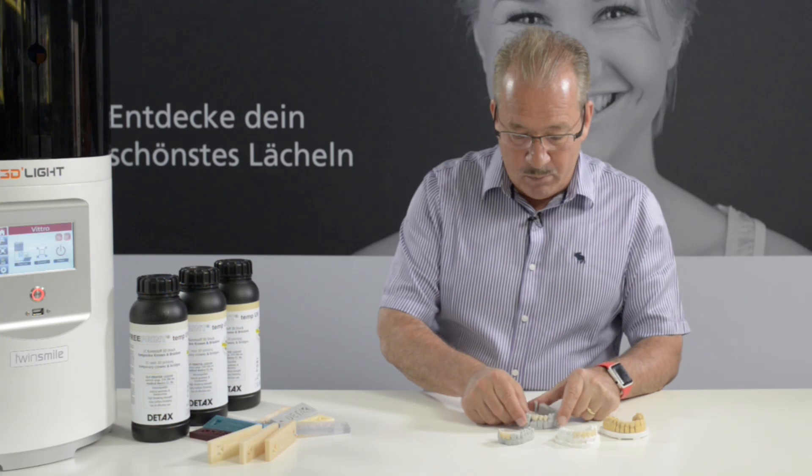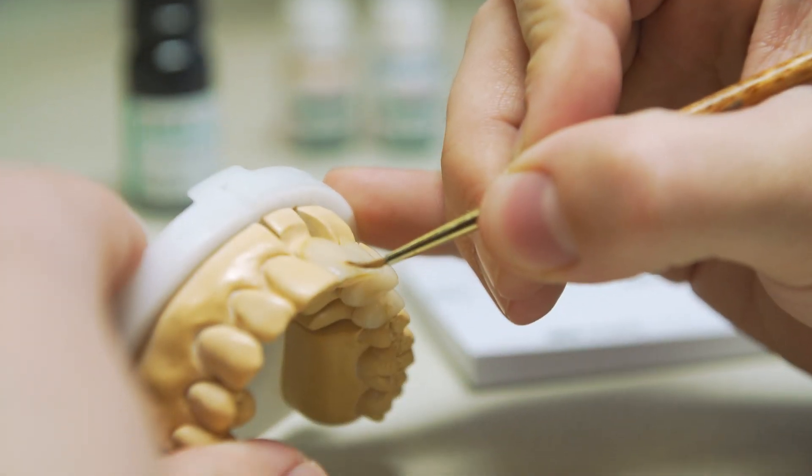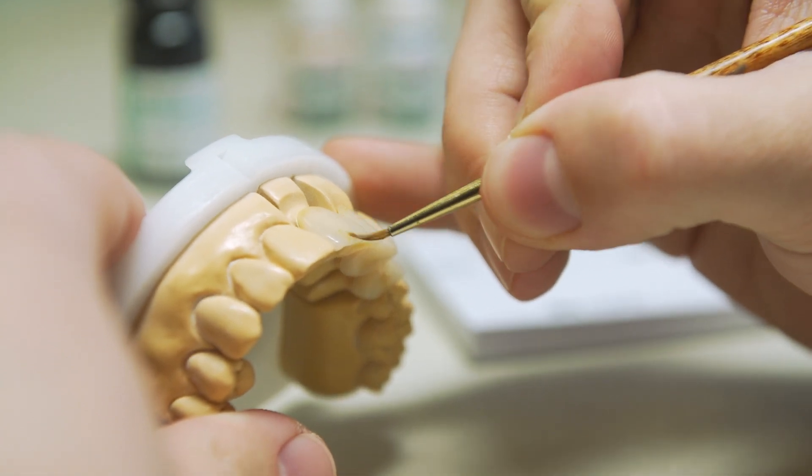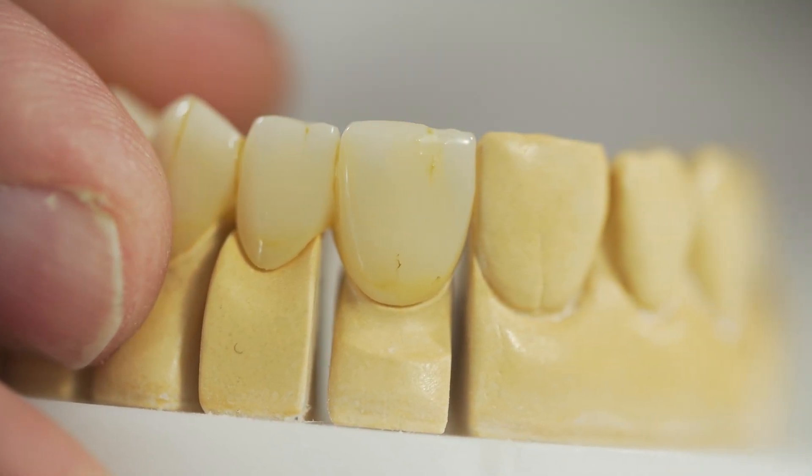When you produce them, they're very easy to polish and very easy to modify. So you can basically, if you want to add stains, add them wherever necessary and do any kind of corrections.